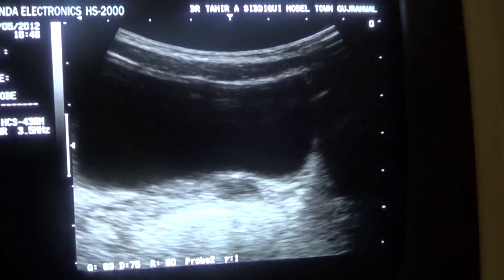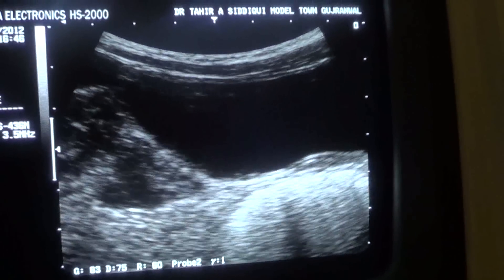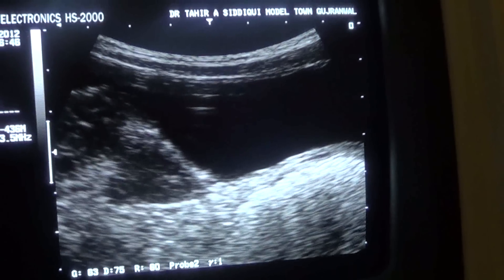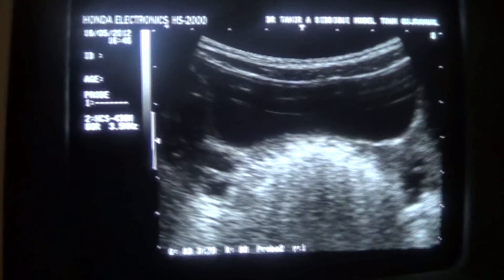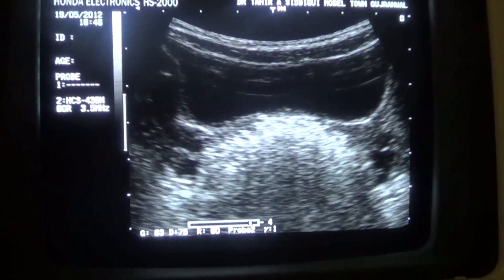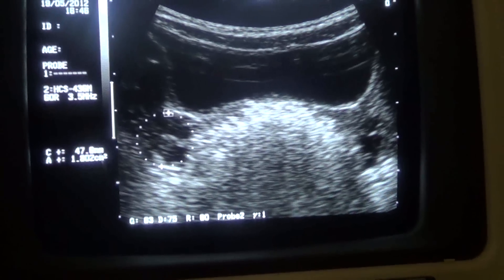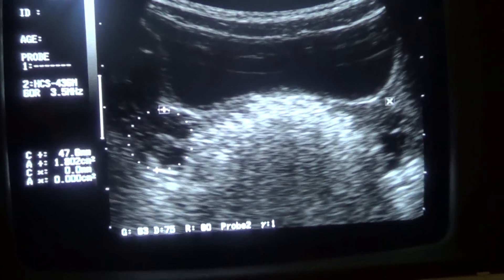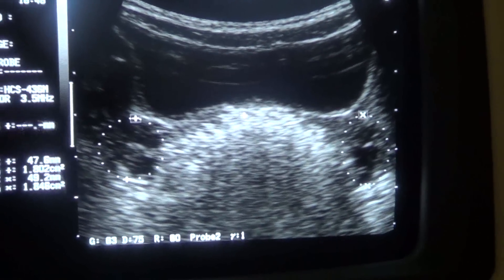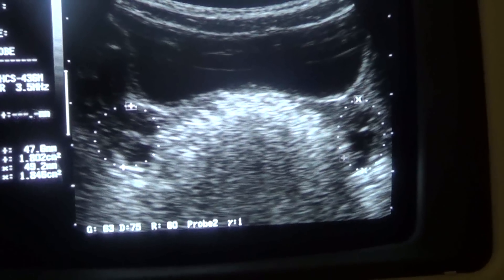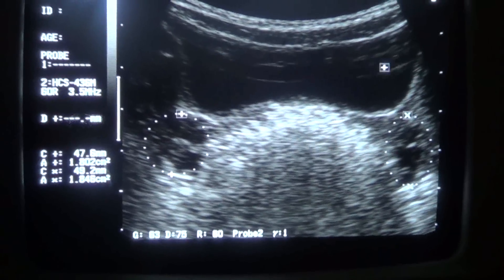Now let's see the ovaries. Here you see the right ovary with follicular activity in it — developing follicles are visible within it. This is the left ovary with follicular activity, as you can see the follicles are developing. These black cystic areas are the developing follicles, and this is the urinary bladder.